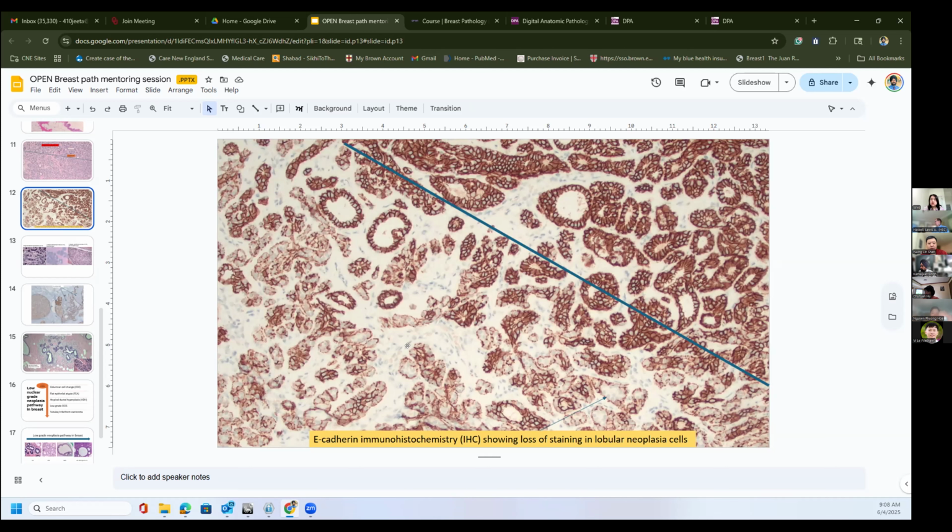Yeah, good question. In a way, you have to think about histology as an artifact that you can reproduce, right? So we are reproducing this artifact of fixation, staining, and looking at the cells and able to make a diagnosis. Sometimes artifacts are introduced that are not part of that protocol. And that includes autolysis, thermal cautery, frozen section, and all that.